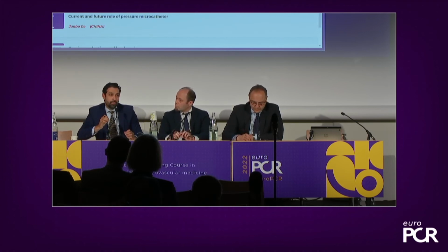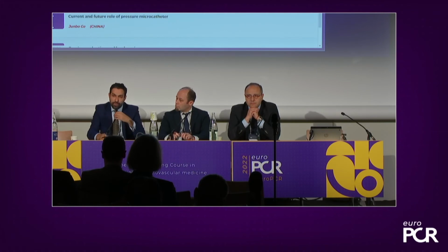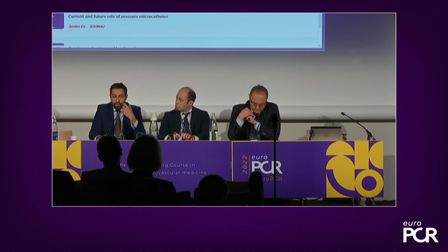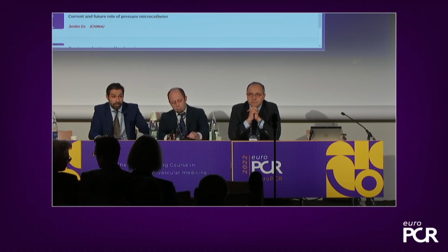Why is this important? Because PCI is a focal therapy. So if, and you have seen the data that I presented on angina, you treat patients with focal disease, that patient will do pretty well. That's a patient that will come without any residual symptoms, and we believe that those patients, based on the research done on post-PCI FFR, will do pretty well long term.